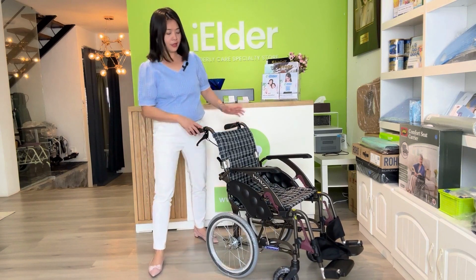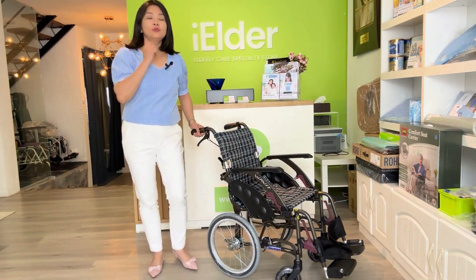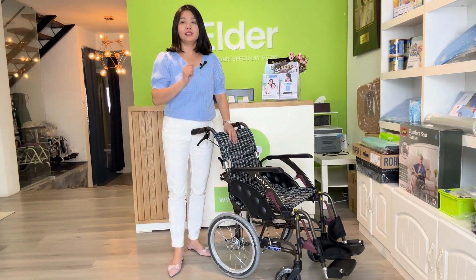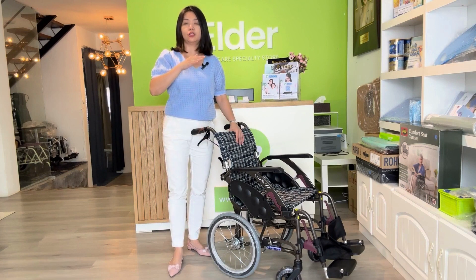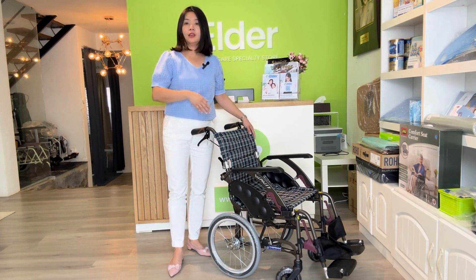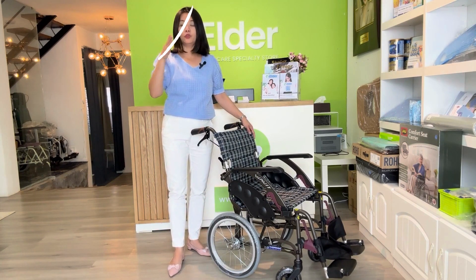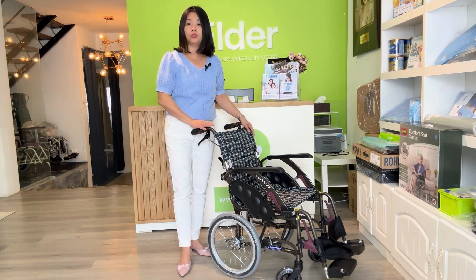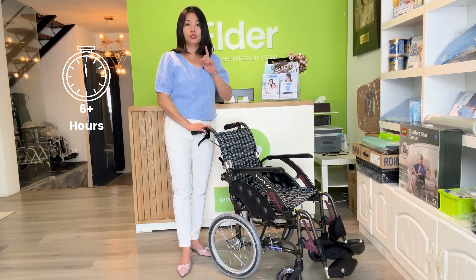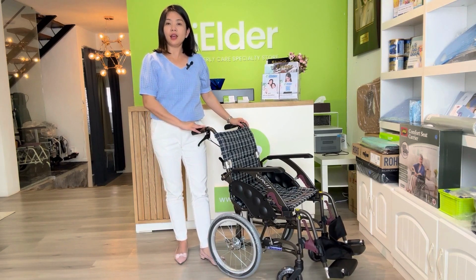So now we look at this product. This wheelchair comes with the WAVIT name. What is WAVIT? WAVIT is that they design such a wheelchair to follow the human body structure. A normal wheelchair comes with an L-shape, but this one comes with a curl-shape — the human body structure. That's why when a person sits on the wheelchair for more than six hours, you should consider a very suitable wheelchair for them to increase their quality of life.